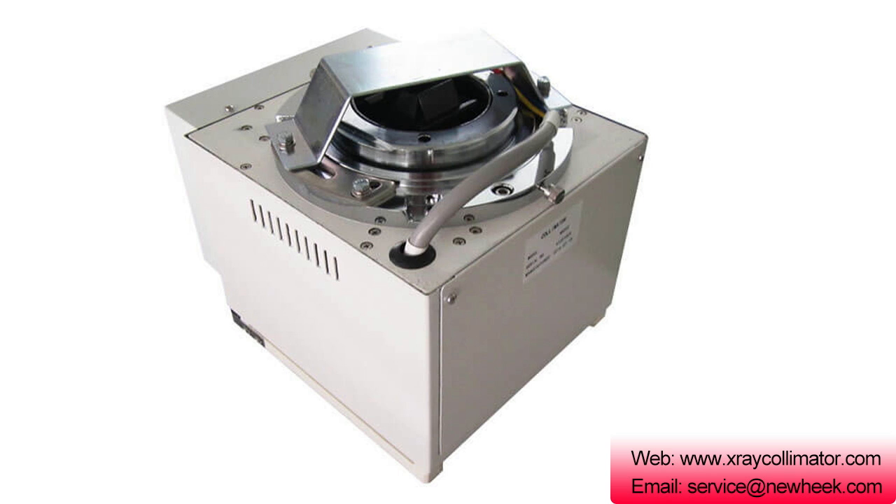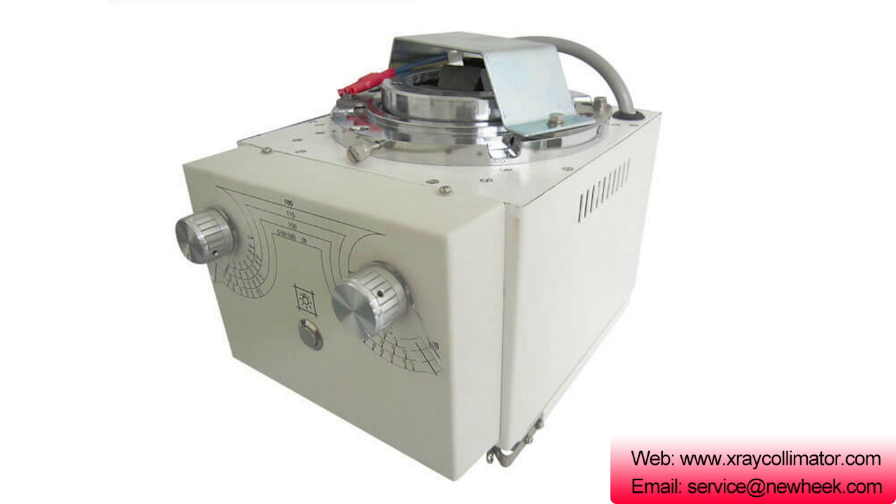The purpose of the multi-leaf collimator is to accurately align the radiation beam emerging from the X-ray tube assembly to the size of the object to be displayed. Next, let me introduce you to the three X-ray collimators that Nuheek sells.